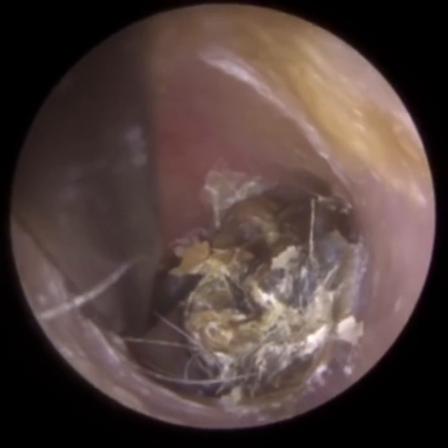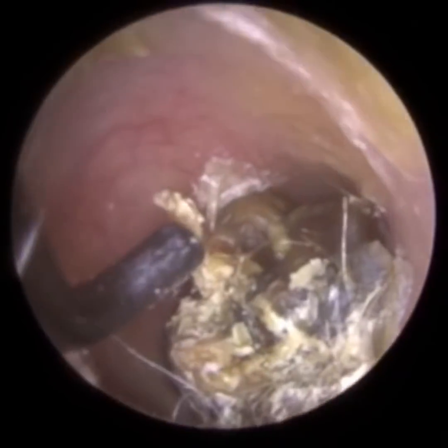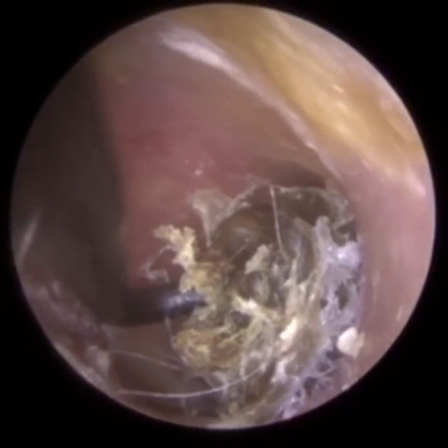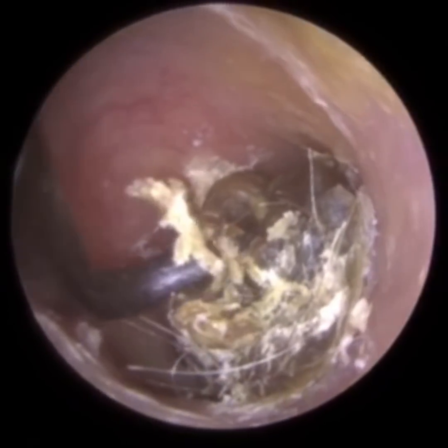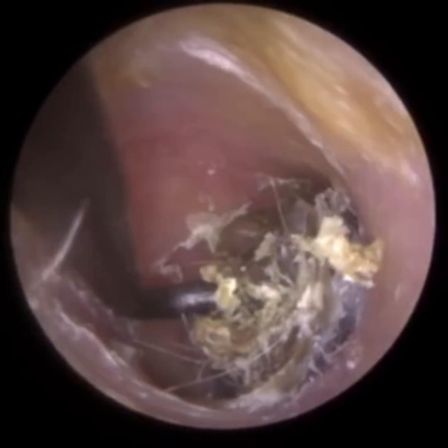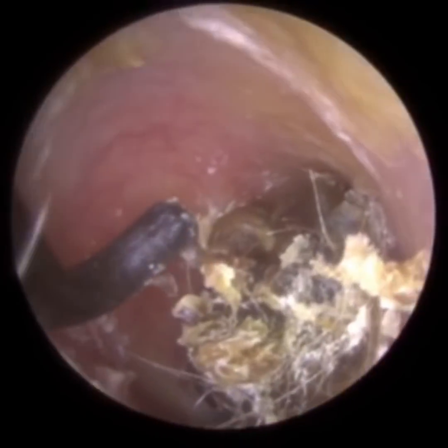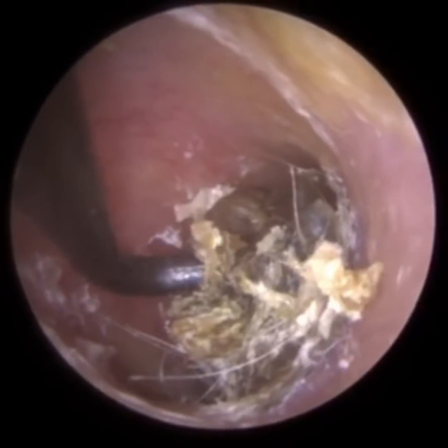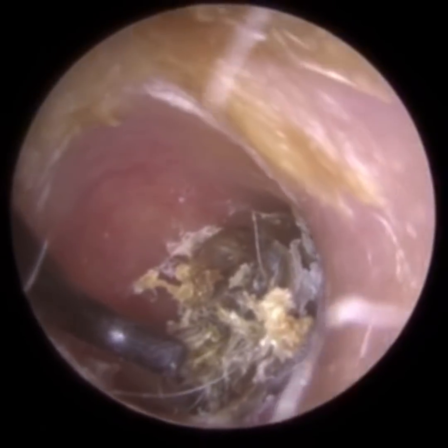This is really deep in there — it's lodged beyond the isthmus. Typically I try to resist the urge of using mechanical instruments like hooks and scoops when the wax is in the inner two-thirds, because if we come in contact with the bony part of the ear canal it can be very sensitive and uncomfortable for the patient.